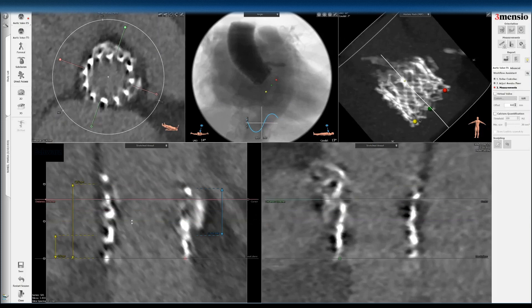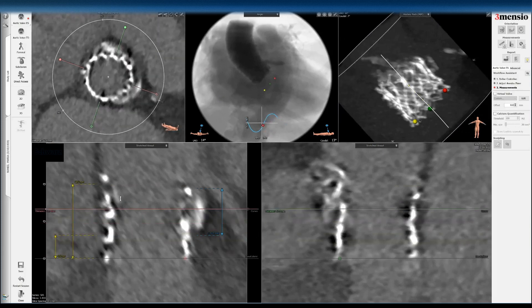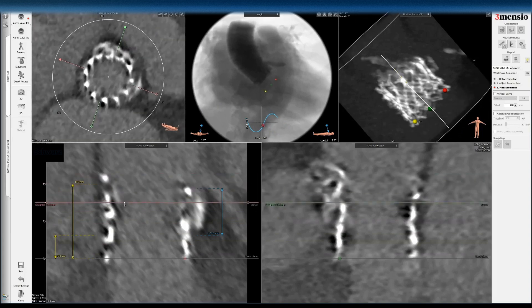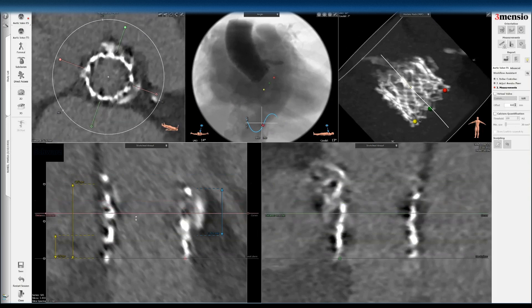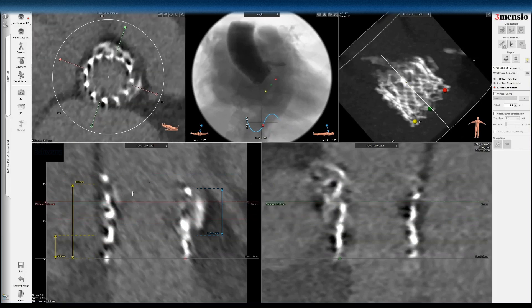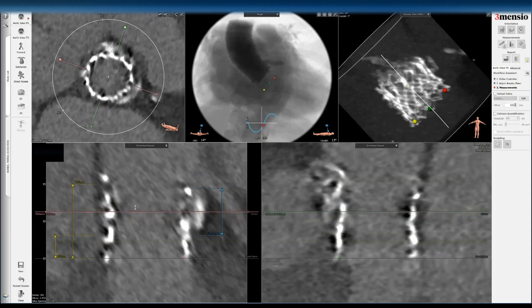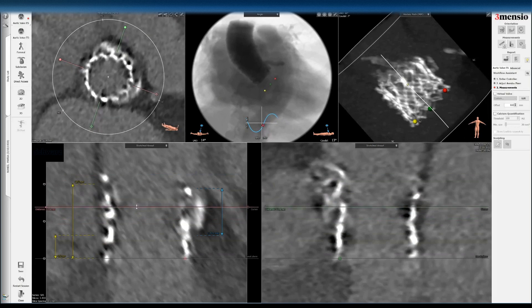Now let's look at the valve orientation. With motion artifact it's hard to delineate the commissures, but you can see some indications — slightly thicker areas indicating commissure posts, since double-line mounting occurs at the commissure. One trick is to use a diastolic phase at 75%, because with diastole the valve leaflets should be closed and you can get better orientation assessment. Unfortunately for this patient the diastolic phase had significant artifacts, so we're using the systolic phase.